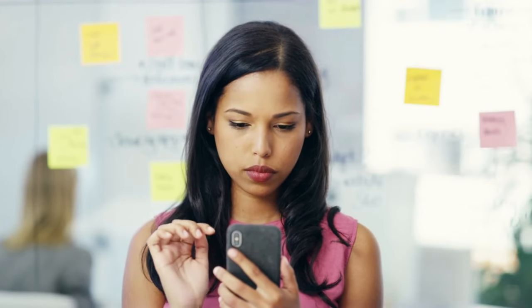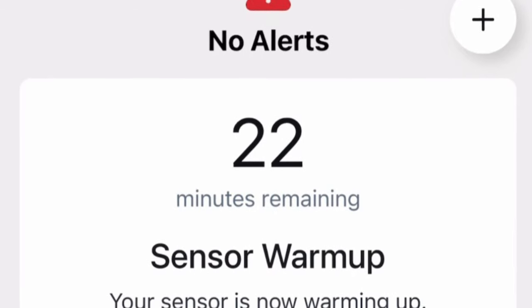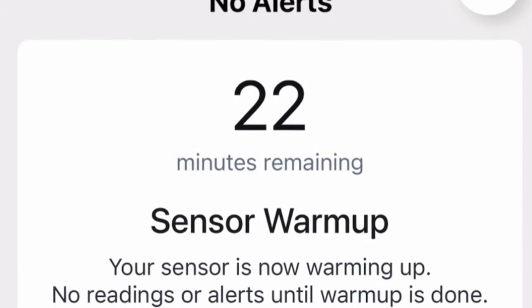So back to those magnets — this is both a good thing and a little bit of a bad thing. This is good because many of us have applied a new sensor and then a few hours later realized we forgot to hit the start sensor button. This eliminates that from ever happening again. In fact, after I applied the sensor, I got caught up doing something else and didn't come back to the app for a few minutes to put in the sensor code. When I went into the app, the sensor had already started warming up and was already down to just 22 minutes left.